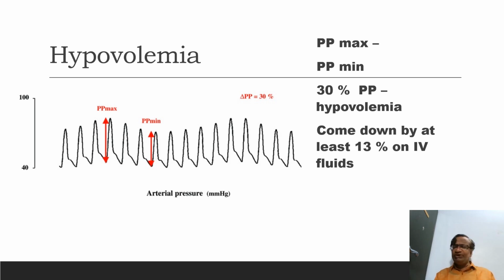So, you know that this is there. We can see invasive blood pressure. What will be sometimes the other uses? How to analyze the waves? Now, this is the PP max. This is the PP minimum.